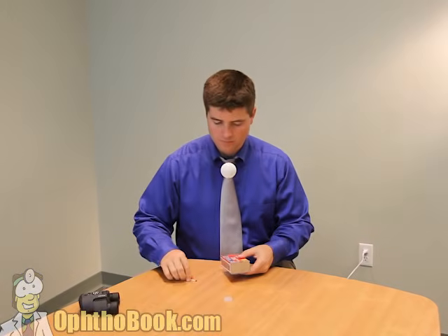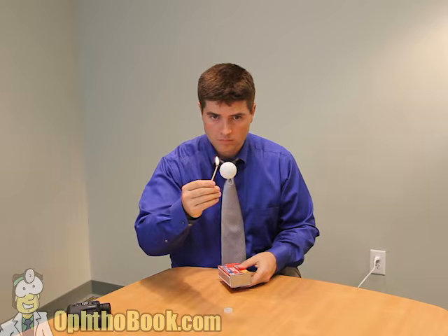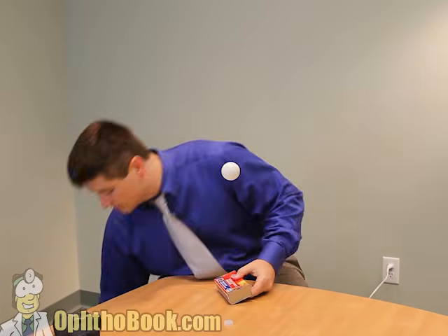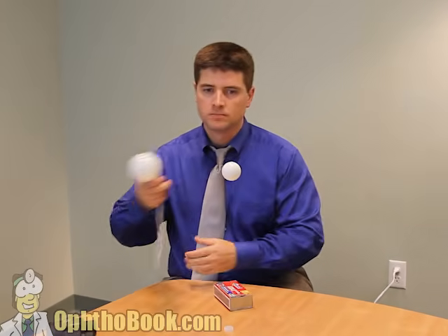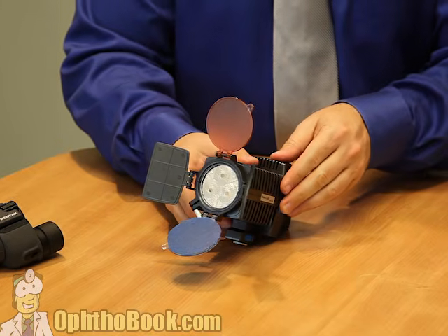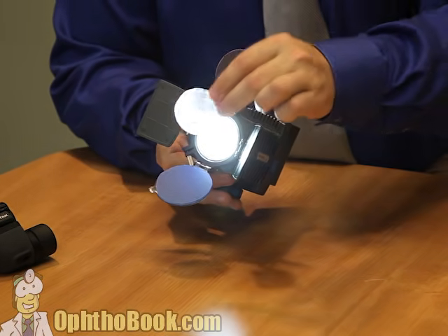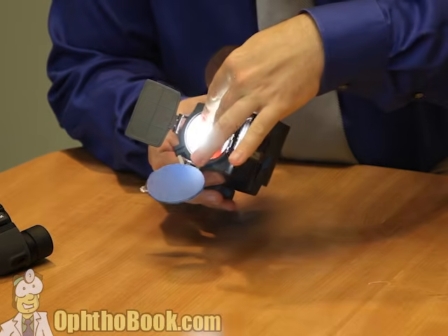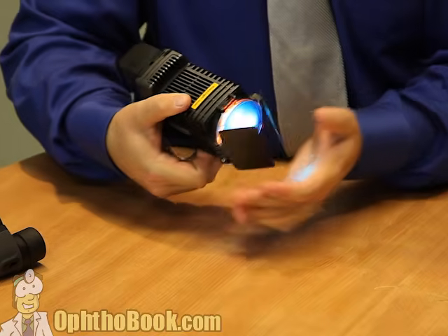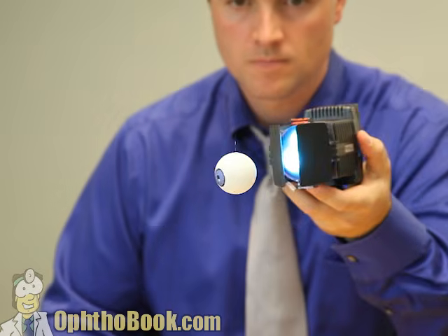So far, so good. Now we need a light source. Early microscopes used the sunlight or even flame, a candle, to look at the eye, but it's just not enough light, and as we know, the eye is sensitive to flame. So with the invention of electricity and the light bulb, we improve our design and start using a light bulb to see what we're doing. But once again, not ideal. But what if we improve our light, put it in some type of housing so that it's very bright? In fact, we can even focus our light using a lens in the front. It adds some filters onto the light in order to look at different structures in the eye. And we can even put barn doors so we can create a slit of light, a beam of light. And this is a better way to look at the eye. And now we have basically an excellent light source.